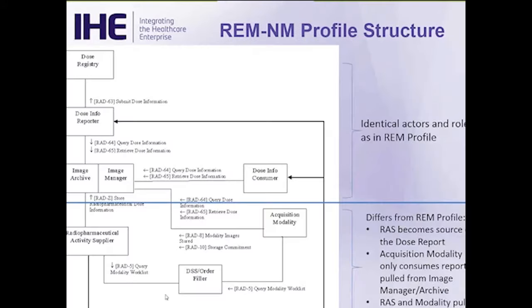So if we look at the actor diagram for this profile, this is what it looks like. Everything above the blue line is identical to what we saw in the REM profile. So all of those actors do the same things. The only difference is they're looking at the structured report for the radiopharmaceutical instead of the X-ray administered dose. But their roles are exactly the same. The differences are below the line.